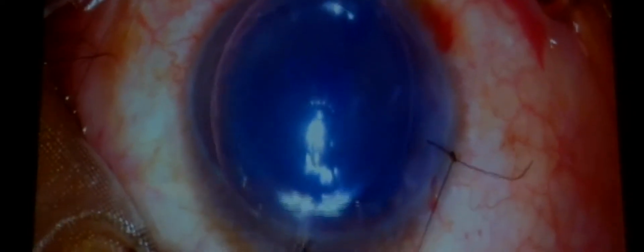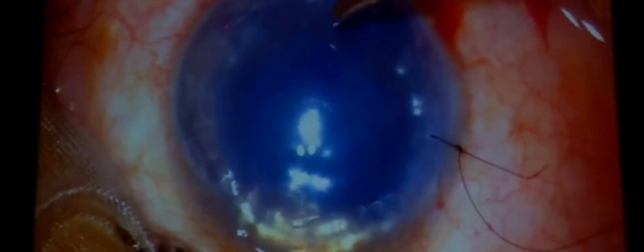Instead of using air, knowing that in these eyes the tamponade may be required for a longer period of time, and since we have not stripped the Descemet's membrane, we know that a donor DM sticks better to the bare stroma than to the host Descemet's membrane. We placed SF6 complete fill, and then put a bandage contact lens on the eye.